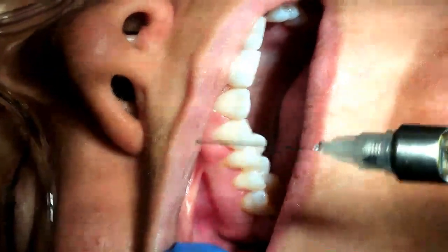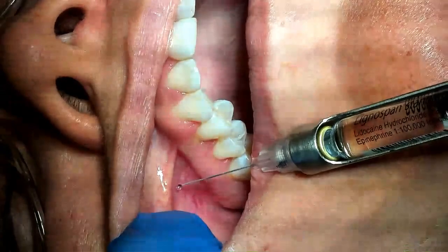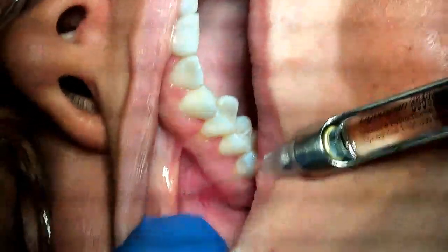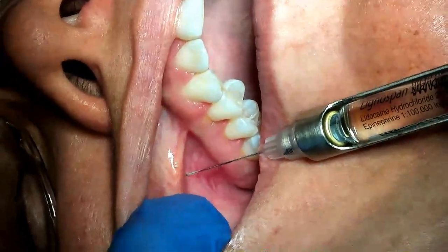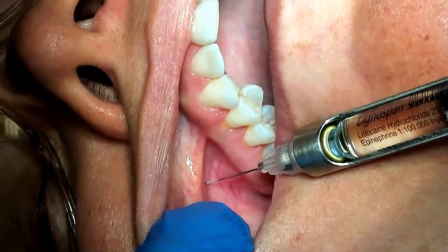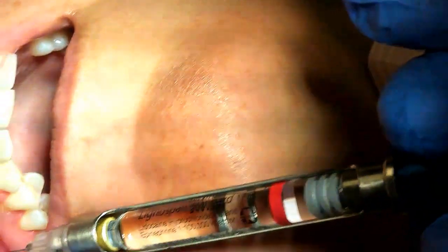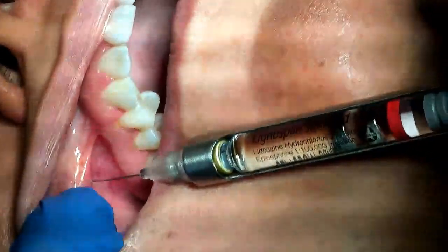I'm going to parallel the second bicuspid, and at the height of the mucobuccal fold I'm going to identify my point of penetration right here, and penetrate to a depth of about 6 to 12 millimeters. You just want to be above the apex of the tooth to get good anesthesia. I'm going to aspirate, then rotate my syringe about a quarter turn and re-aspirate. Both of those aspirations are negative, and then I'm going to go ahead and deposit there.